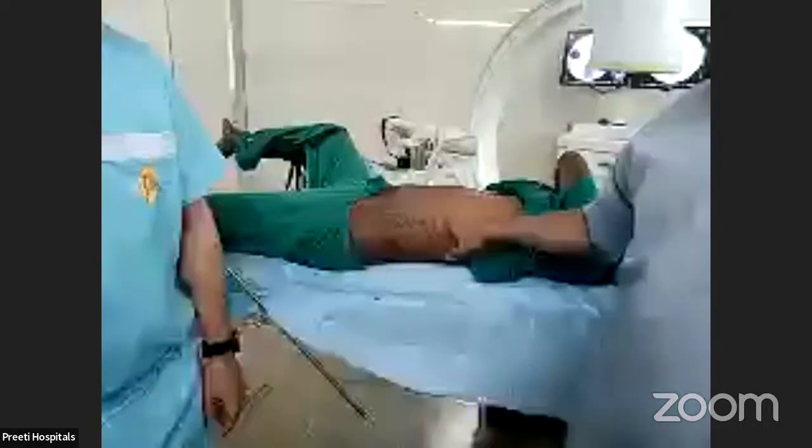So in this case, you go to the upper calyx, remove it. You go to the pelvis, remove it. Whereas here, it will be like this. Going from here to here is okay, but from here to here, coming down is difficult. So there is no point doing PCNL if a large stone is present in the upper calyx.